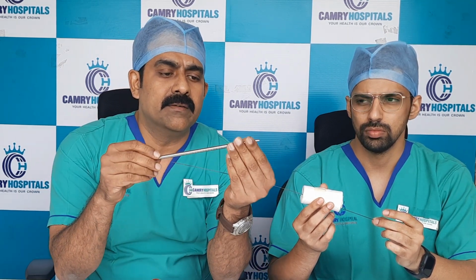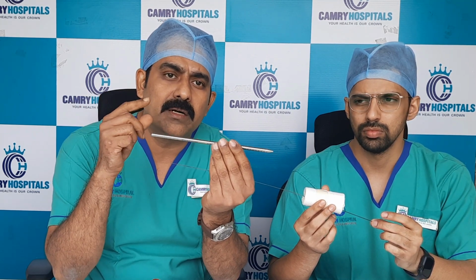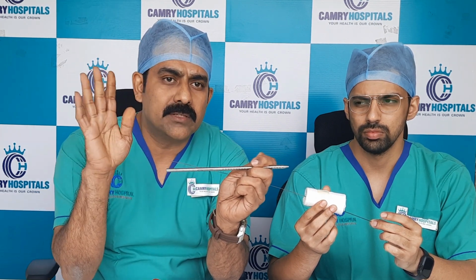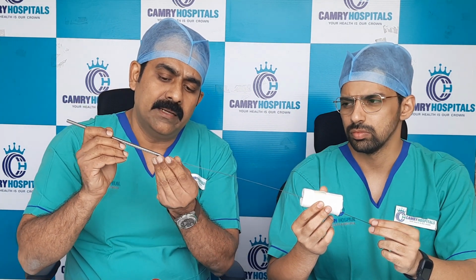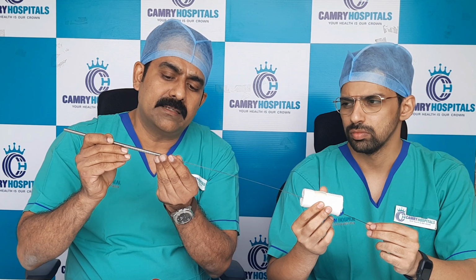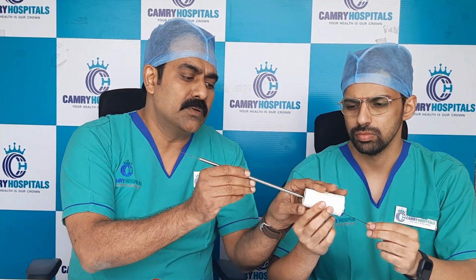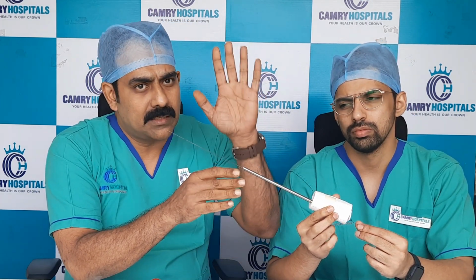This is again a very smooth pointed dilator. When it goes inside the tissue, the tissues don't get cut, the tissues just dilate. So there is no tissue damage in this surgery. Once we confirm the position in the disc, there is a 1 mm diameter in this dilator. It's called the obturator. It goes through the guide wire into the disc. Then again we will check the position under the image intensifier.